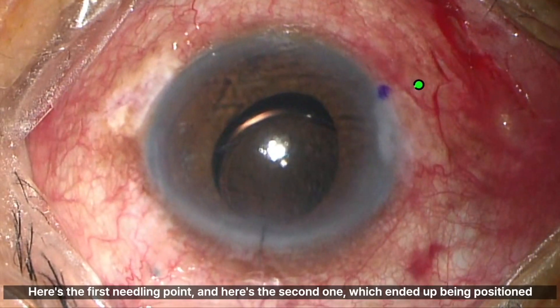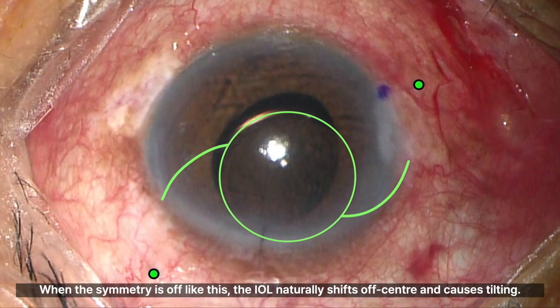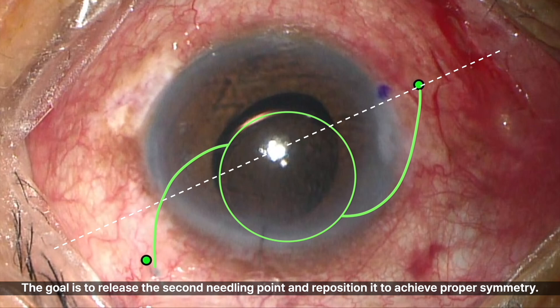Here's the first needling point, and here's the second one, which ended up being positioned too superiorly. When the symmetry is off like this, the IOL naturally shifts off-center and causes tilting. The goal is to release the second needling point and reposition it to achieve proper symmetry.